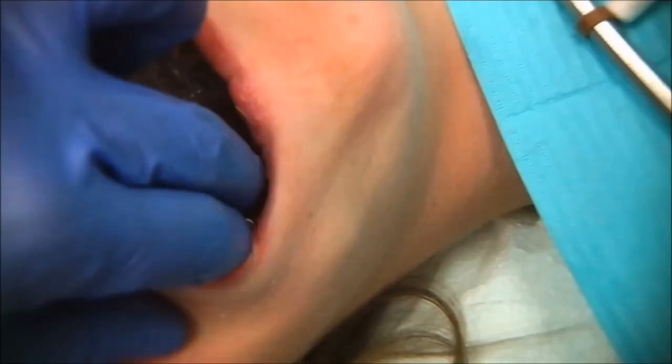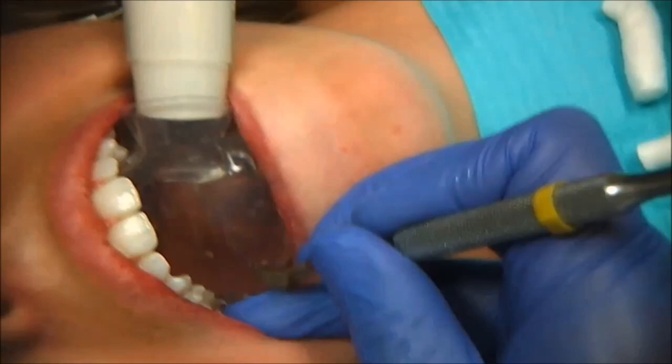While you're applying pressure and helping extrude all the excess cement — maybe a little bead around the margins — cure the onlay. But only do a partial cure; you don't want to over-cure the onlay, because the next thing we're going to do is clean the cement. Research shows that with pressure we actually enhance the cementation process.